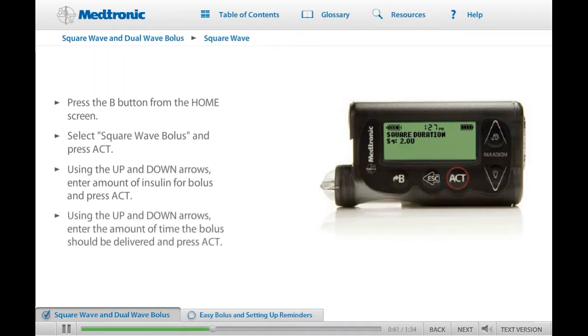Now the Square Duration screen will appear. Enter the amount of time over which you want the square wave bolus to be delivered and press Act. The Bolus Delivery screen will appear. While the bolus is being delivered, the screen will show the type and amount of the bolus for approximately 30 seconds and then go back to the Home screen. The Home screen will display an open circle indicating that the pump is in special mode. The pump will beep or vibrate at the start and end of the delivery.